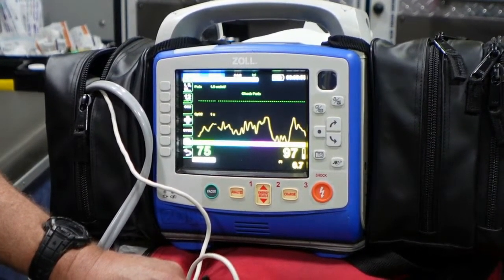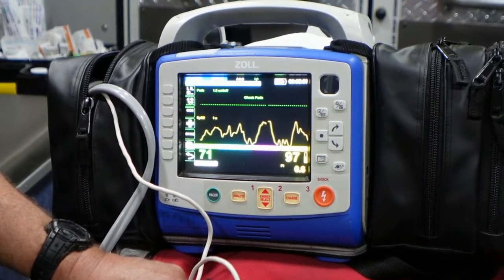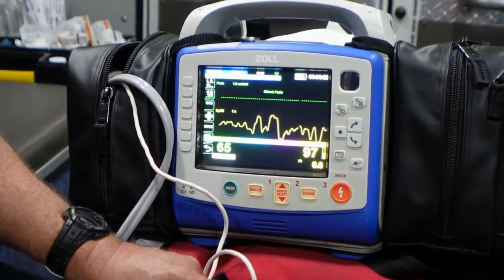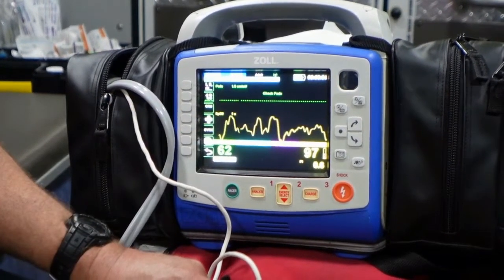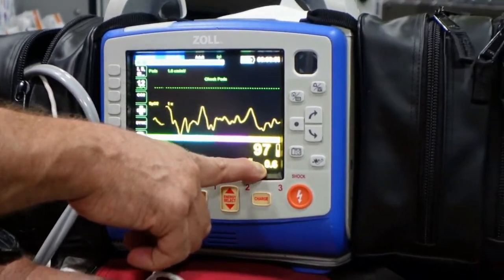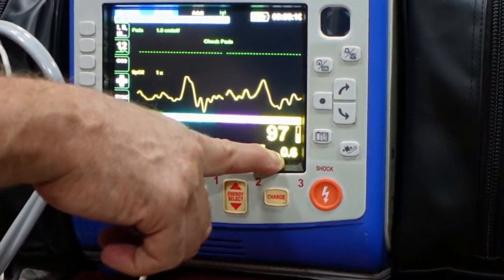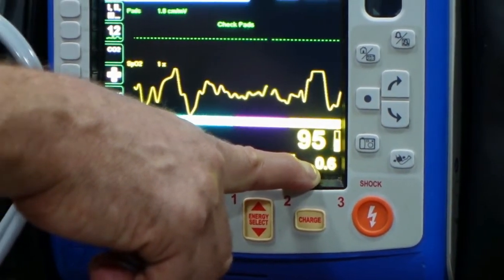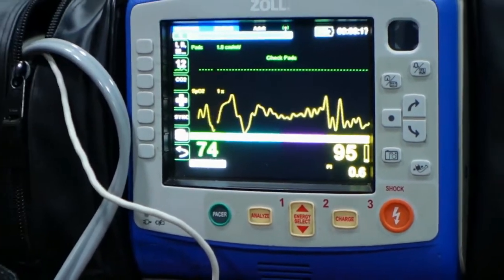You notice it's still reading a number — the 97%. Well, if you don't have a good plethysmograph matching your heart rate, the numeric value that the Pulse Ox is showing right here is no longer quite valuable. Also, you see a pulse index — the PI right there — it's showing a 0.6, which indicates a low accuracy level. Once I take off the tourniquet, this number should go up, showing a much better, more reliable pulse.